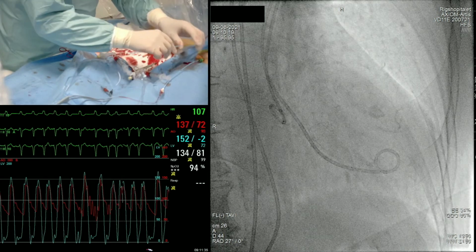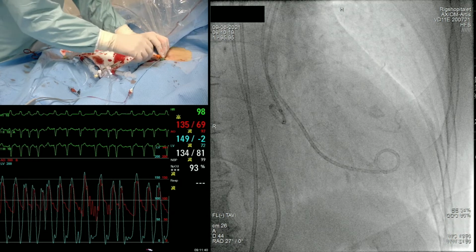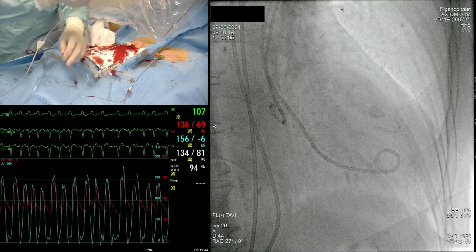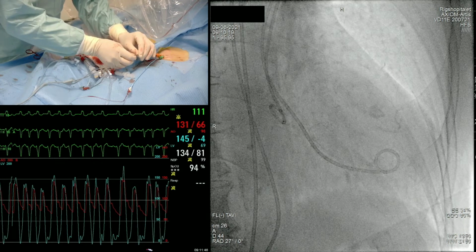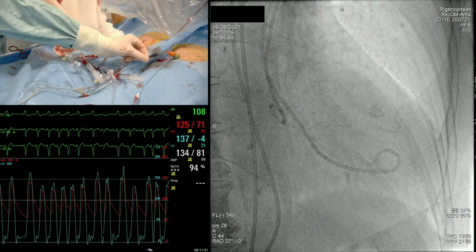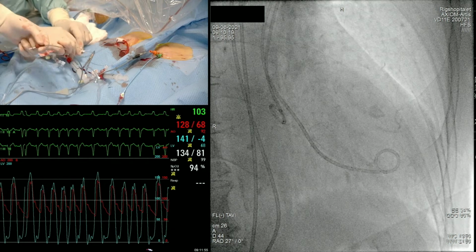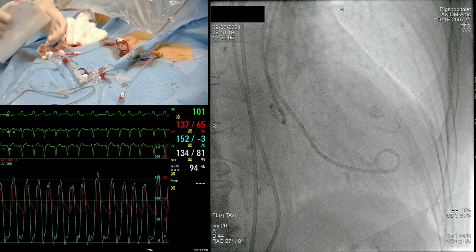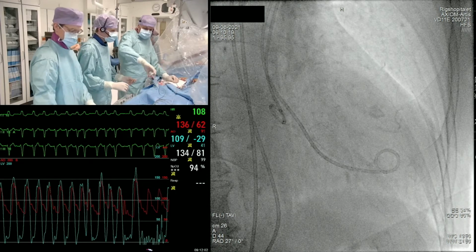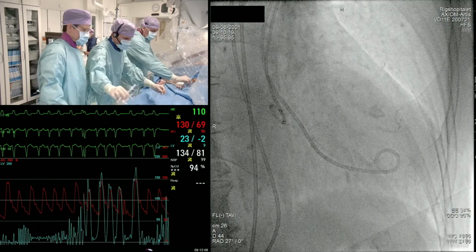But I'll just put this dilator into the 7 French sheet in the vein here with a short guide wire. Yes, so Lars has just introduced this short wire, that's the wire that comes in the package with the sheet and goes intravascularly. One end of the crocodile electrodes goes on there, and then the other one will go, of course, on the stiff guide wire. Okay. This is the Safari extra small. Let's be careful we don't pull on it.